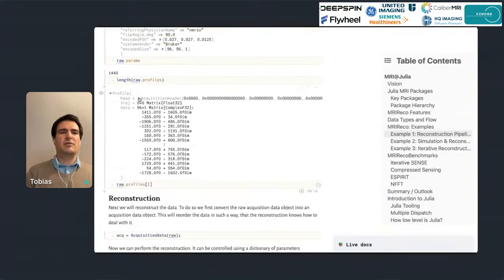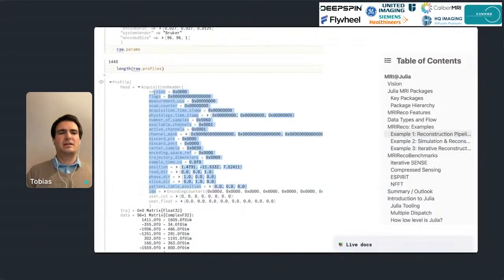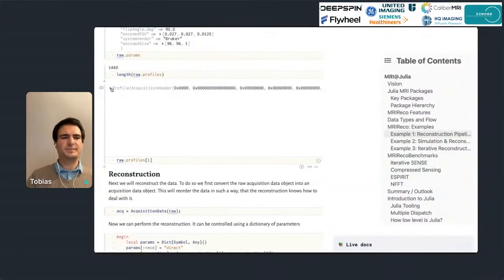And if you find all these namings complicated, I have to say that we actually did not invent all these names, but we used exactly the same elements that are within the ISMRMRD file format. So this is really one-to-one. This is nothing we invented, but ISMRMRD files have proven to be a good container file, and we just replicated that, which turned out to be quite effective.